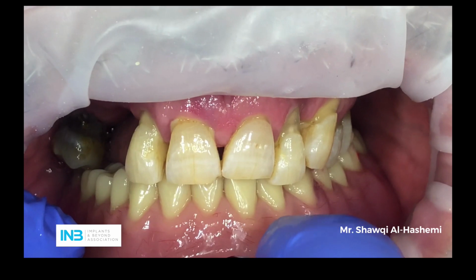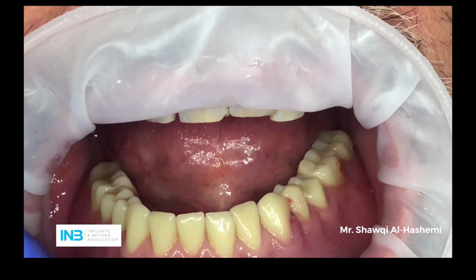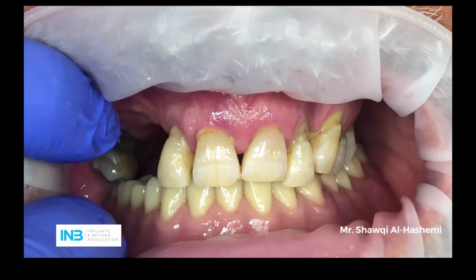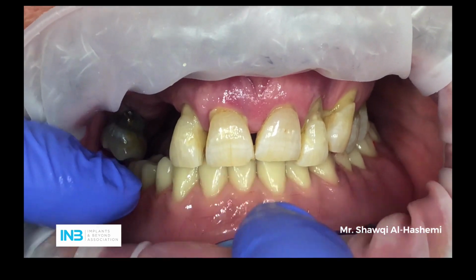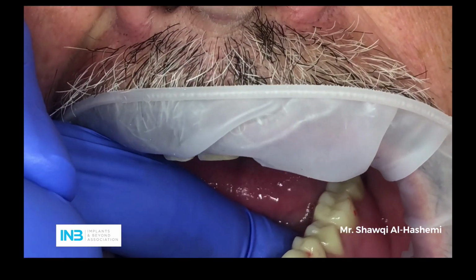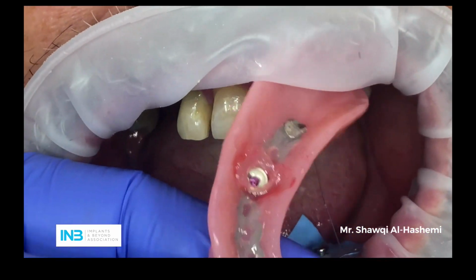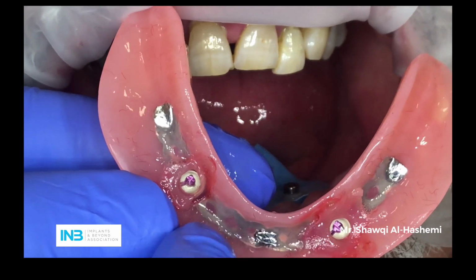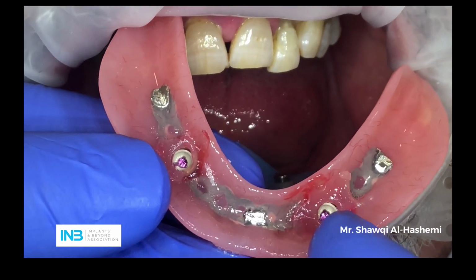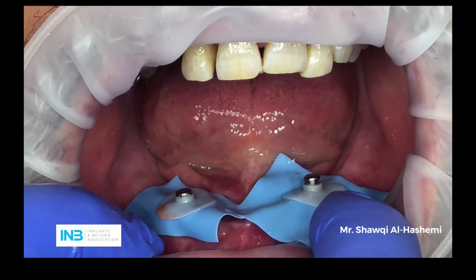Right, open up for us, please. As you can see now, we waited for the resin to set completely. Bite together. You can see the occlusion is good here and there, and the central line is perfect. So open up, and now we're going to take it out. Here we go, and it's out. These are the two housings, and believe it or not, these are the provisional ones.